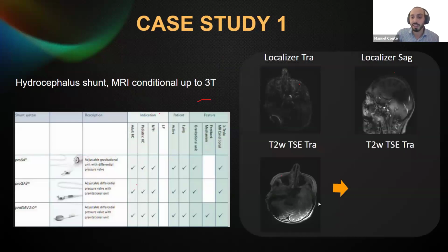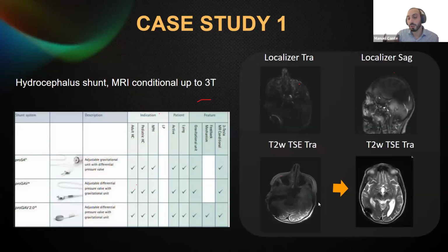After we connected the spine coil, we still get the artifact, but as you can see, the image quality is improved. So basically, in that case, the problem was not the implant, but the coil. So it's not always the metal implant that causes this lack of signal.